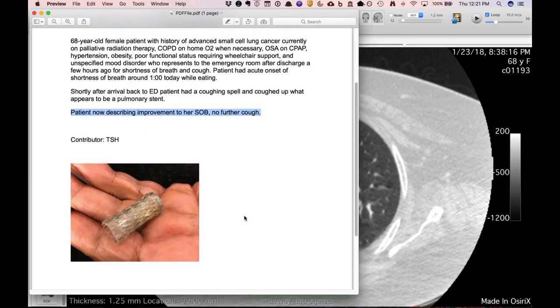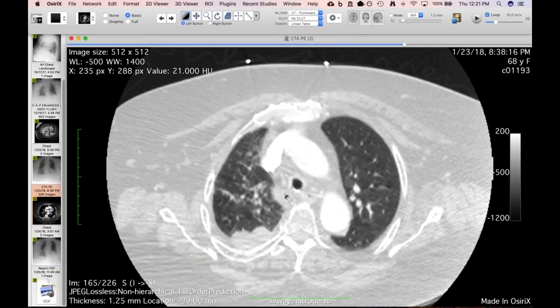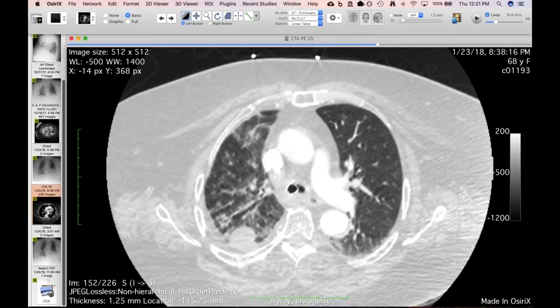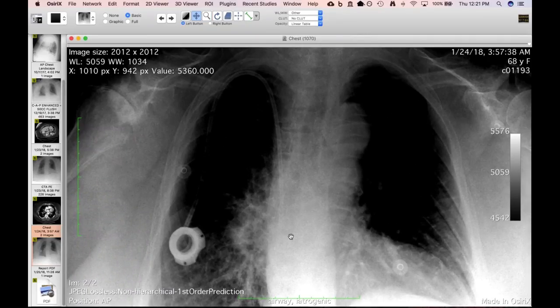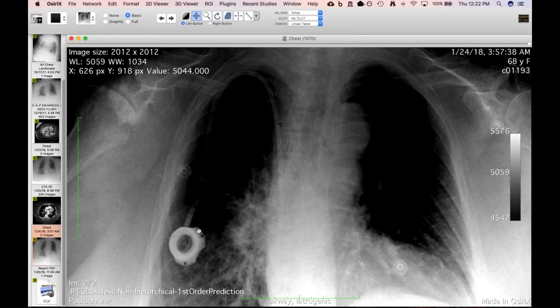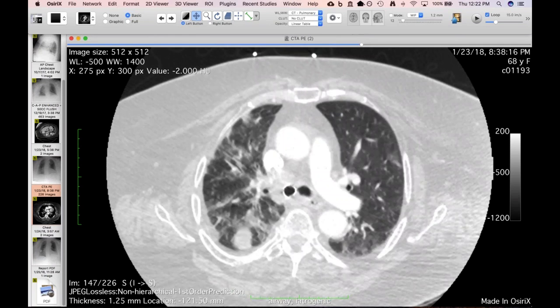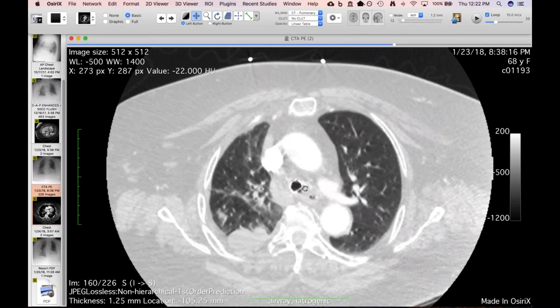There's a picture of the stent. A cool case with a good ending, at least for that — not her metastatic disease. It goes to show you have to be careful looking at these and assessing where stents are. Her radiograph the next day confirmed no stent was present. Stents have a lot of complications — migration up to the level of the carina is pretty bad, and here it was almost entirely sealing off the left main stem bronchus.